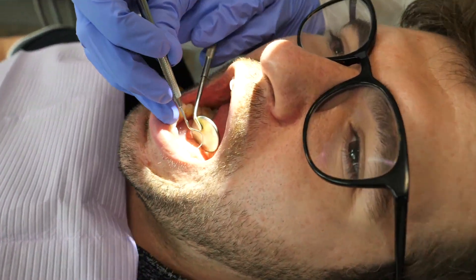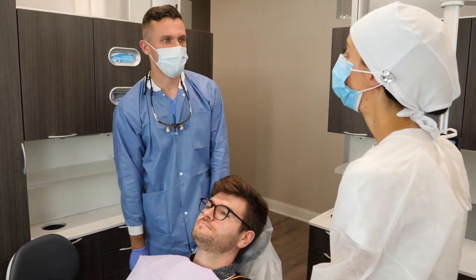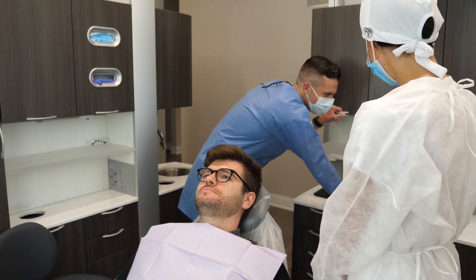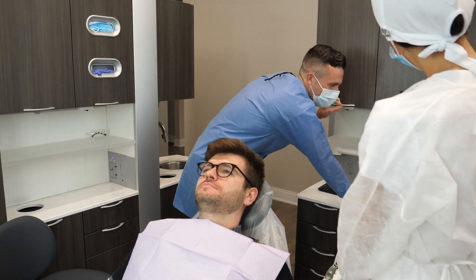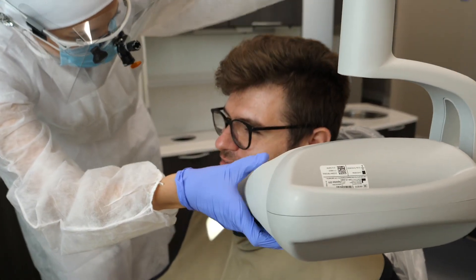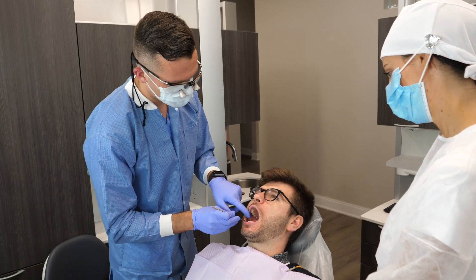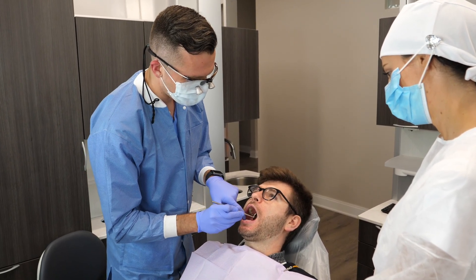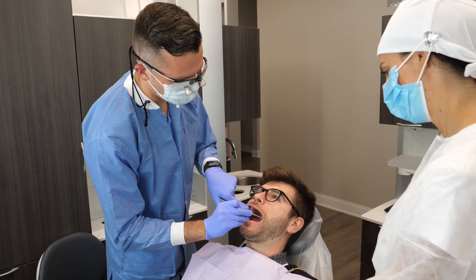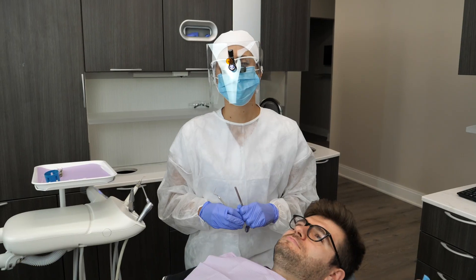If it's smooth, then great. If you're still unsure, you can always ask your boss how they prefer you to handle the situation — do they prefer a post-op x-ray to view if there's any calculus left, or do they prefer you to ask them or another hygienist to double check? Sometimes it's great to have a coworker help you out. Ask ahead of time what the protocol is and you'll be fine.